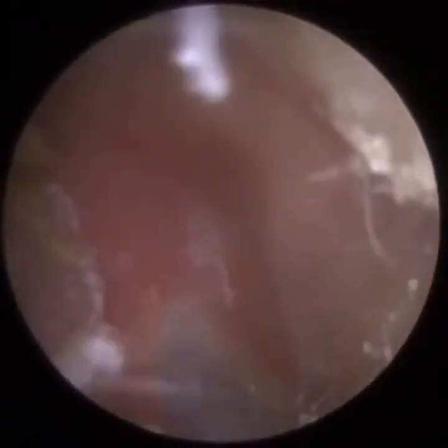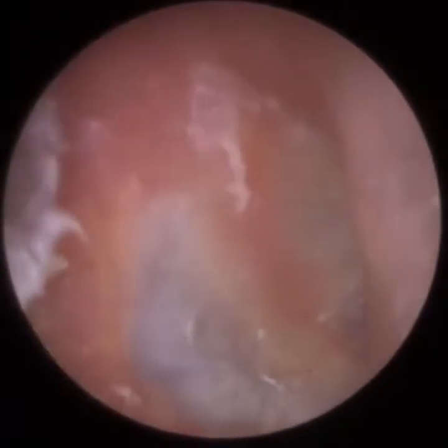There's that little wiggle I was making reference to earlier, and you can see on the right it's detaching itself from the eardrum, and slowly but surely I've managed to remove this from the patient's ear. It was a very rough piece of dead skin. It was like some plastic.